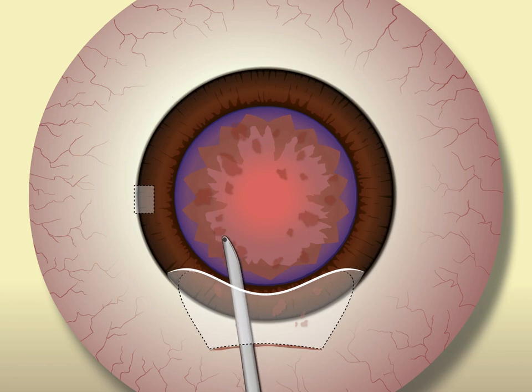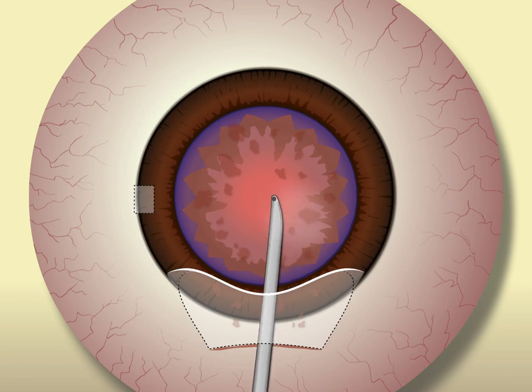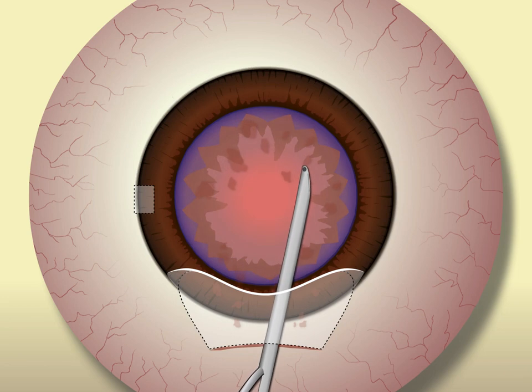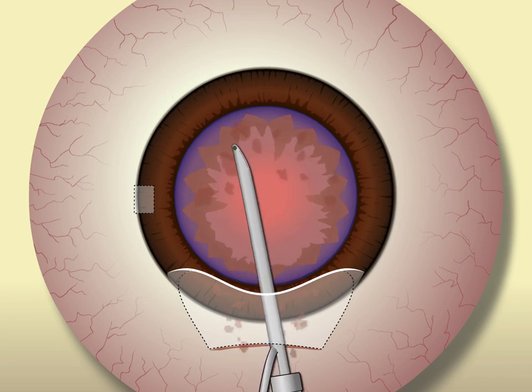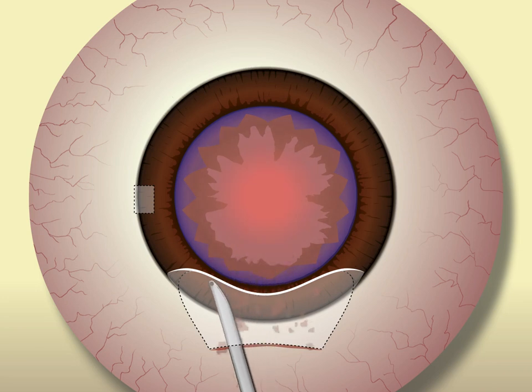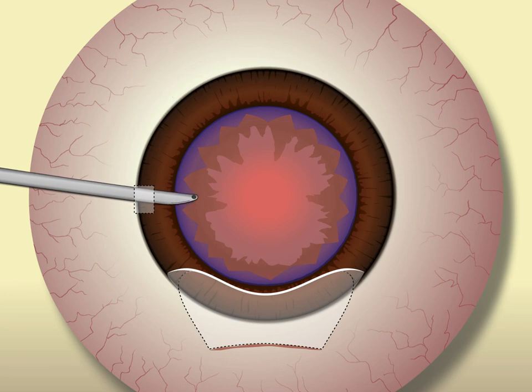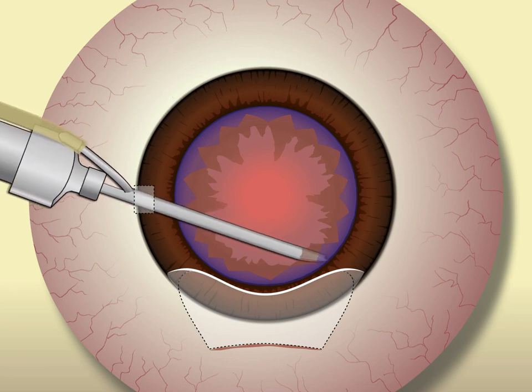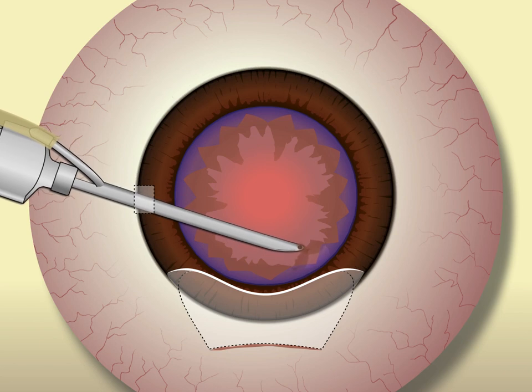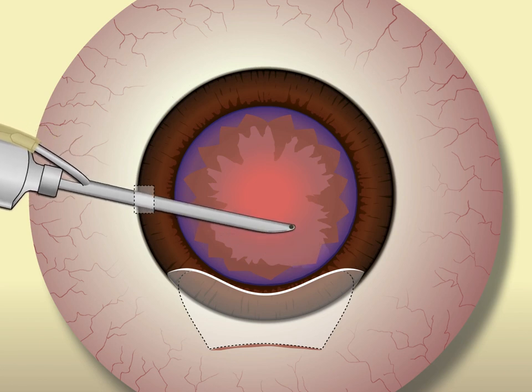After removal of the nucleus, there is always some residual lens material in the anterior chamber or stuck in the incision. This material can be irrigated out of the eye with the Simcoe cannula through the primary incision. Cortex removal can be accomplished by introducing the Simcoe cannula through the side port. This provides good chamber maintenance with excellent visualization during irrigation and aspiration, and easy access to subincisional cortex.